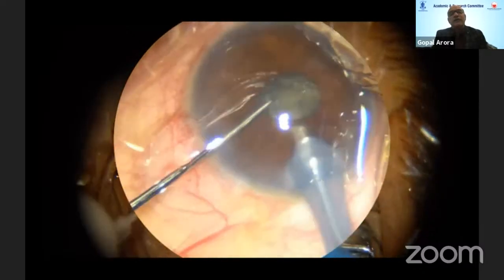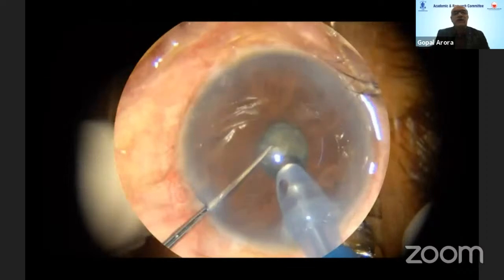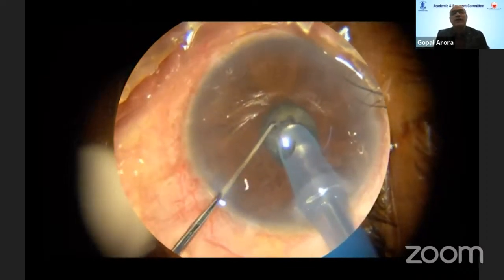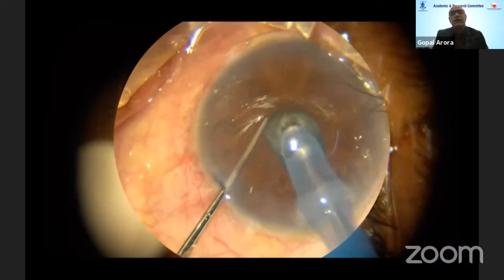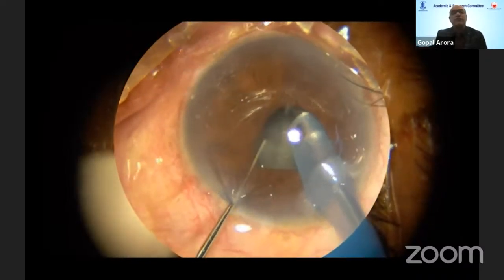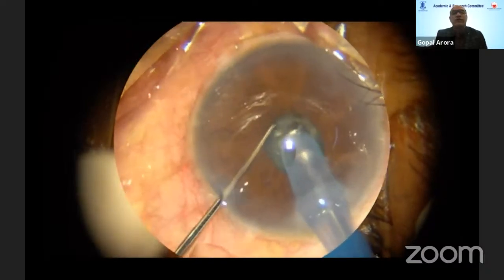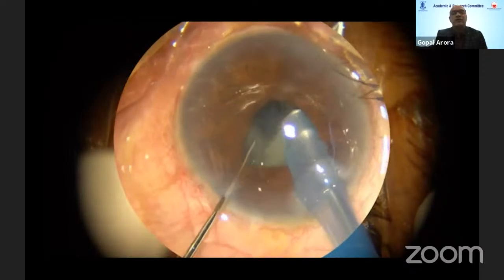And the key here in doing a phacoemulsification procedure is that every step has to be performed exactly in the center of the pupil. If you see, it's almost a 3 to 3.5 millimeter pupil, and throughout the entire procedure, the phaco probe is not at all shifted beyond that 3 millimeter margin.